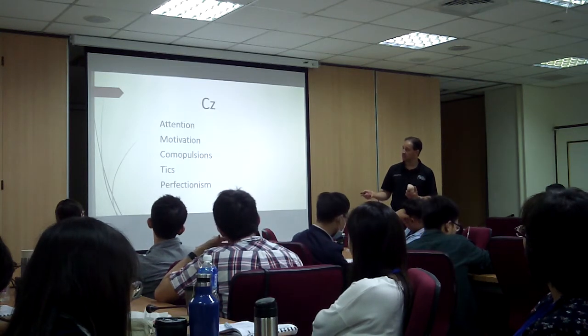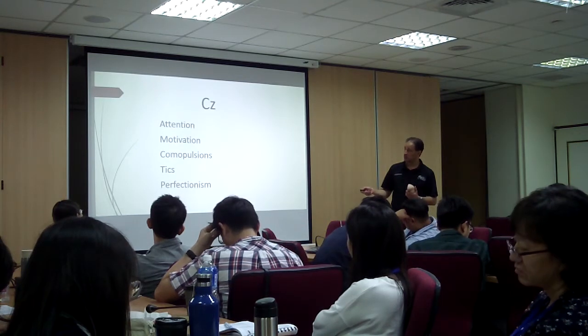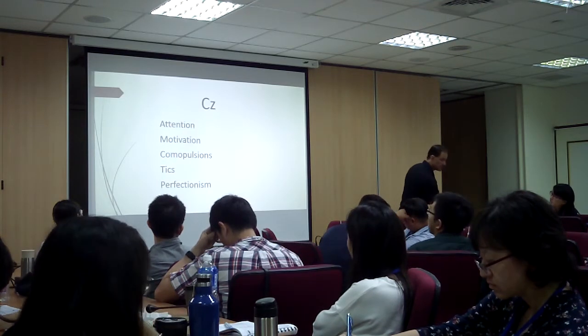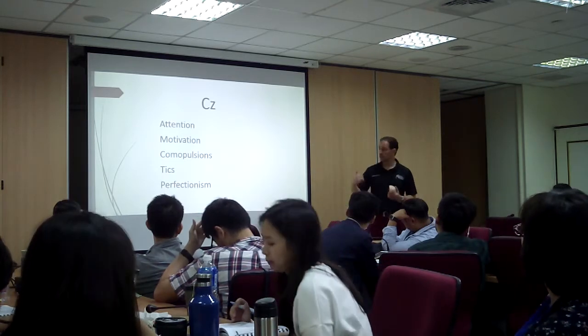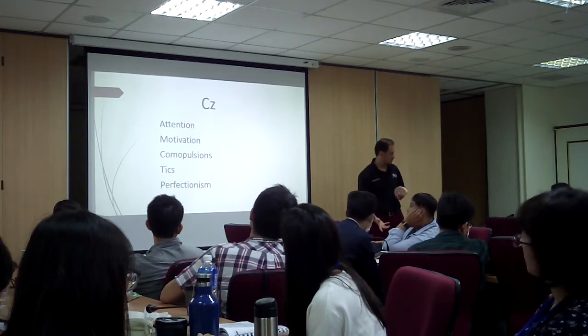So for CZ, we train attention, motivation, compulsion, tics, and perfectionism. Training FC, CZ is a good protocol to help with cognitive flexibility, attention, and being more open-minded.